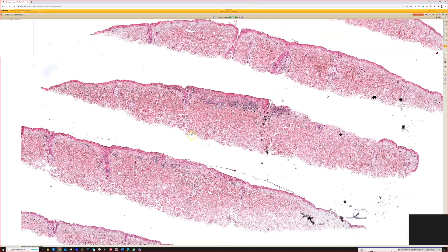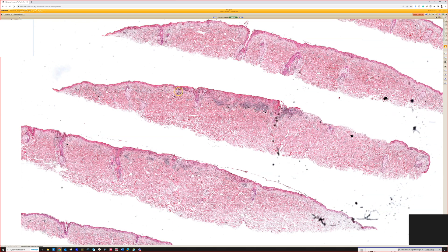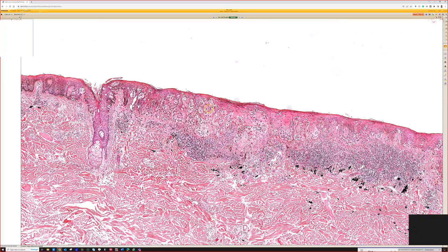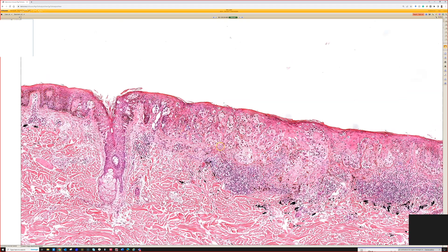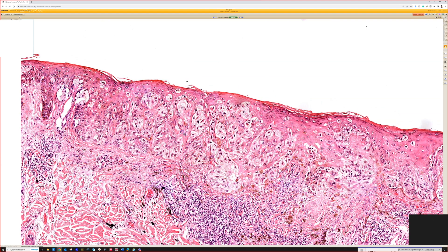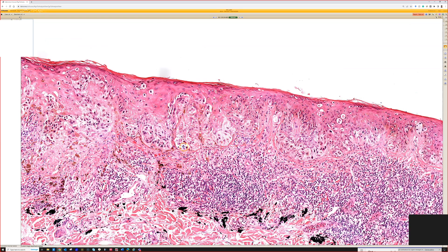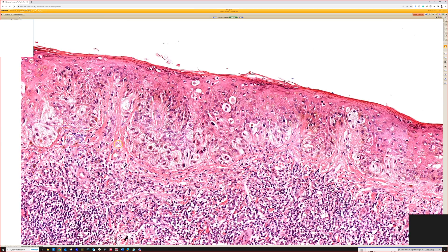From low power here you can see some bridging — you could say fibroplasia, you could think of dysplastic nevus at this area, but not over here. Over here, even though we've got some dysplastic nevus-like architecture, we've got really big atypical cells with abundant pale dirty dishwater cytoplasm and tons of pagetoid spread. Great example of superficial spreading type of melanoma — no doubt about the diagnosis.